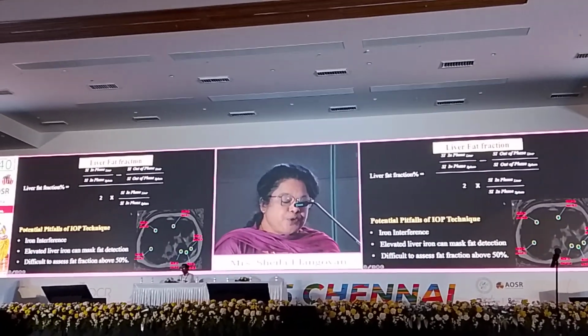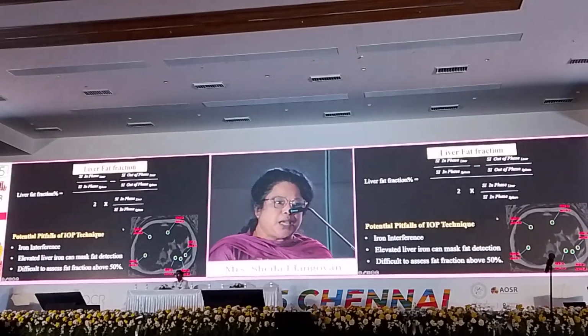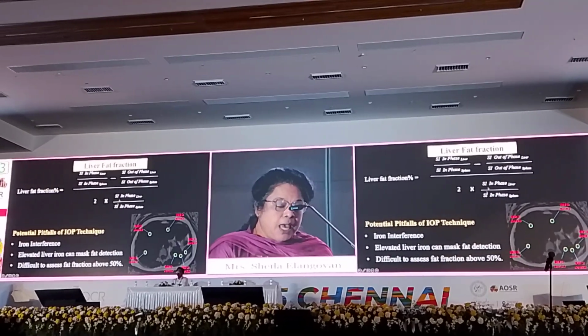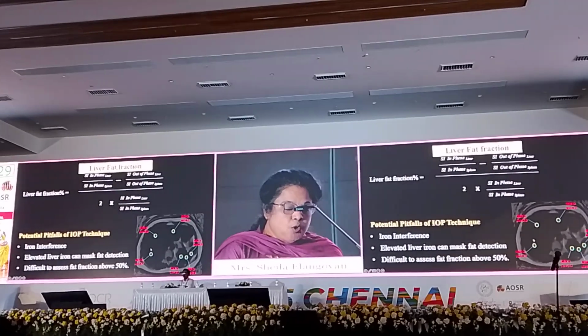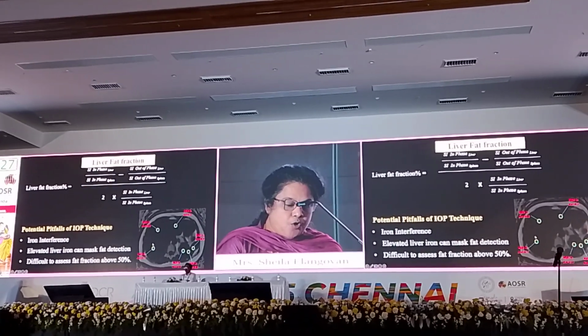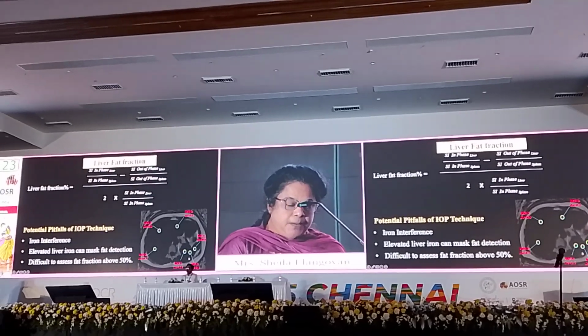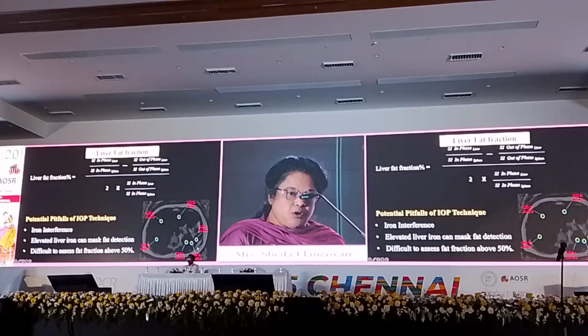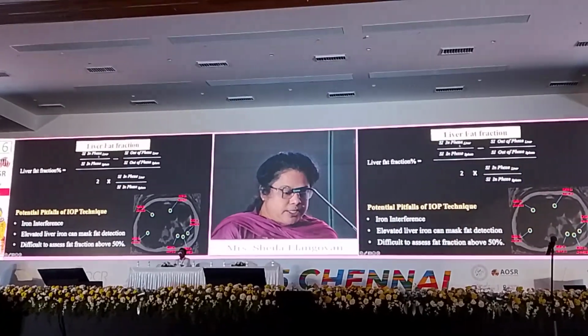So, how do you calculate? That is a qualitative assessment. You say signal intensity changes, hyperintense, hypointense, isointense, but you need to quantify. So that quantification is basically done by drawing similar sized ROIs in the liver, and for a scaling basis, you also draw ROIs on the spleen, and you calculate the signal intensity based on this formula.